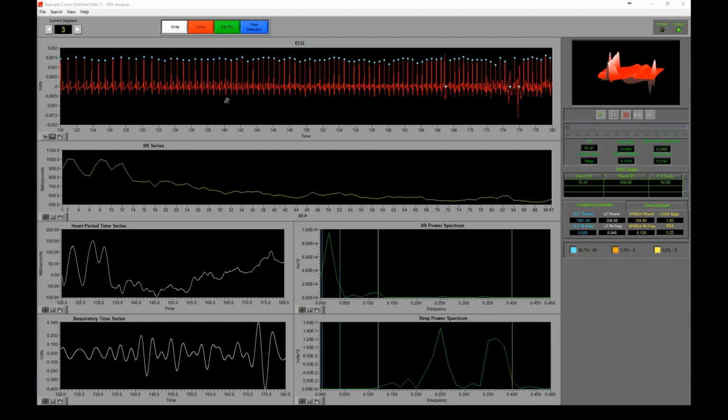and identifying the ECG signal. As long as you follow those rules, the 30-second rule and the 10% rule, it doesn't matter how many inserts or deletes you have to do to accurately identify those R peaks, just do as many as you need to. We're not going to track those, and just always be aware of how many beats you're estimating.